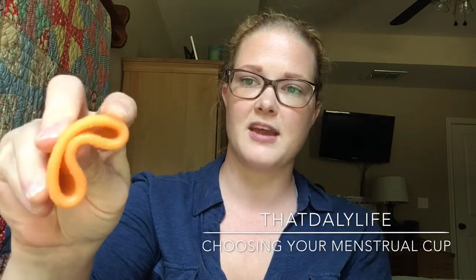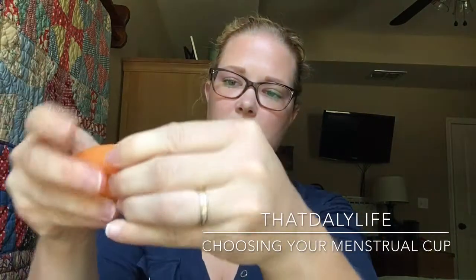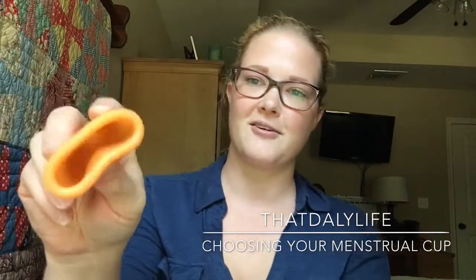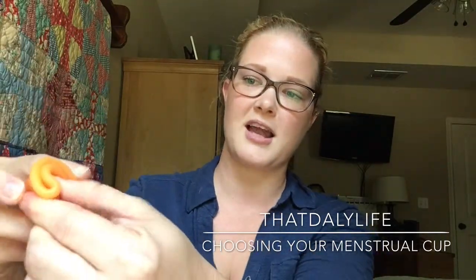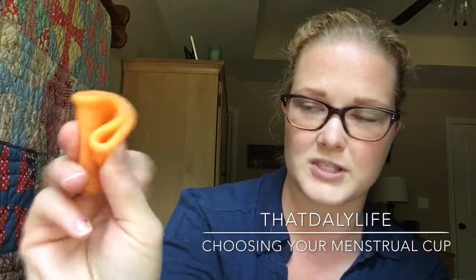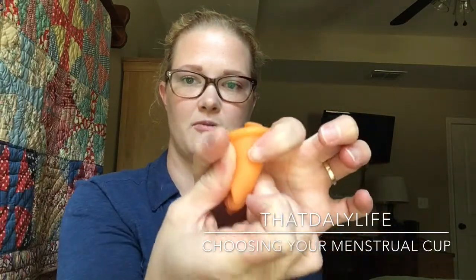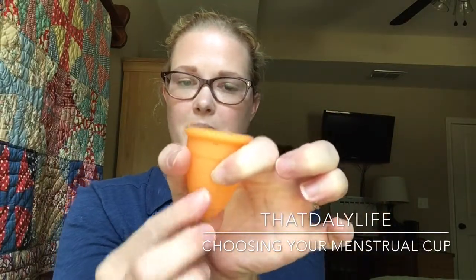The other type of fold that I really like is in half, and then it's called a 7-fold. This is really hard to do when you're actually on a video. So you fold in half and then you fold it over, kind of like the C-fold, but a little bit different. It almost looks like a flower the way it's done. And again, you just insert it like I said before, and once it gets there, it pops open.